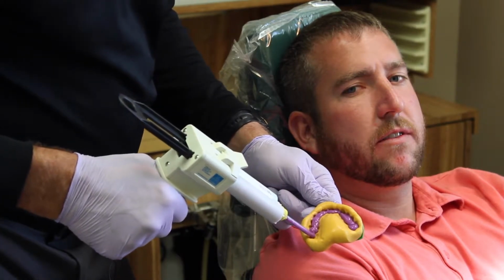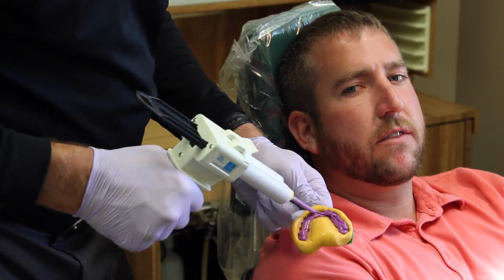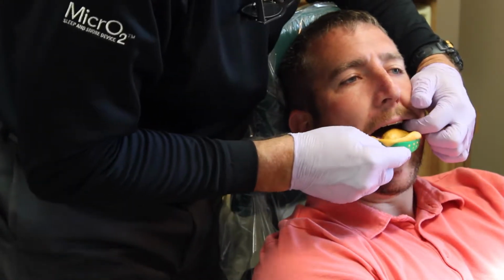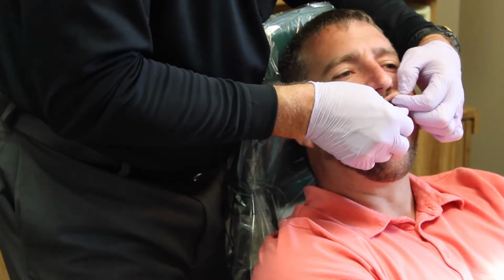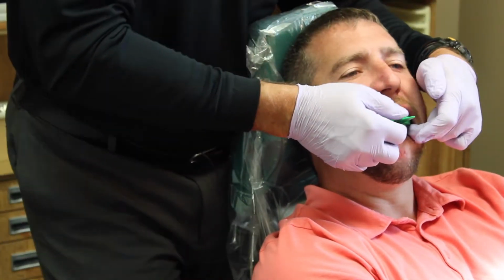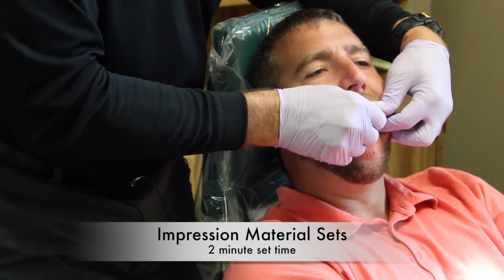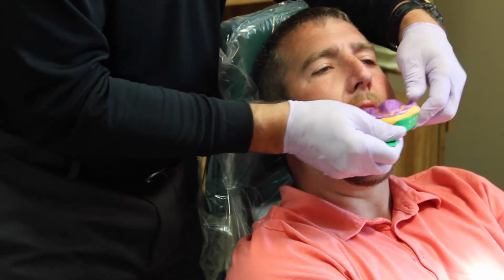I'll generally only fill the area that's tooth-borne here. Make sure that I have that nicely filled up. Return that tray to the mouth. Thank you, Jeff. Seat that fully. And then watch the timer for 2 minutes. Now we'll remove the tray. It's been 2 minutes. Thank you, Jeff.